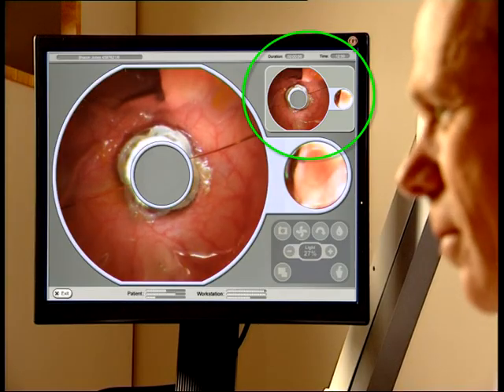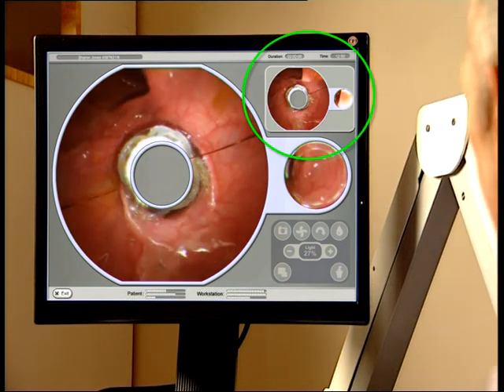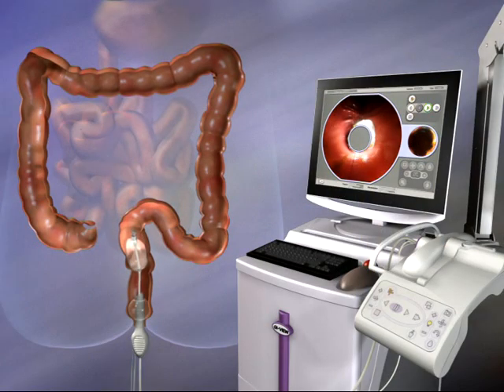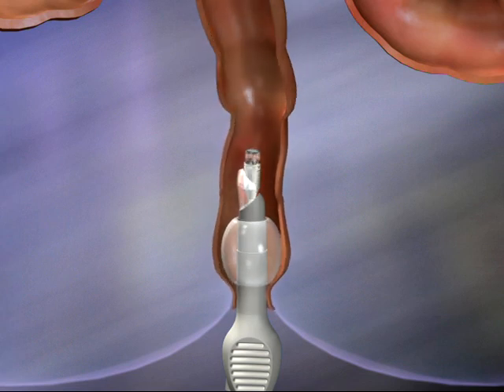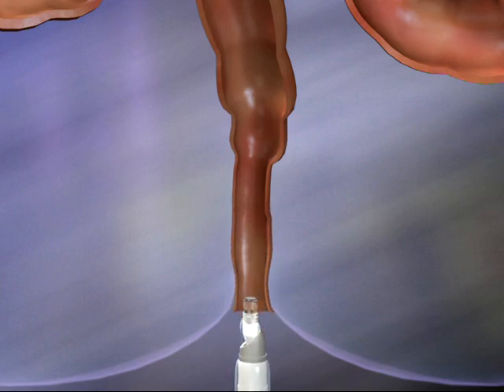As the examination proceeds, the physician may record snapshots of significant findings. As the scanner balloon approaches the rectum, the rectal balloon is deflated, and the operator slowly removes Aeroscope while viewing the rectal walls and floor. The entire procedure is recorded by the workstation for later review.